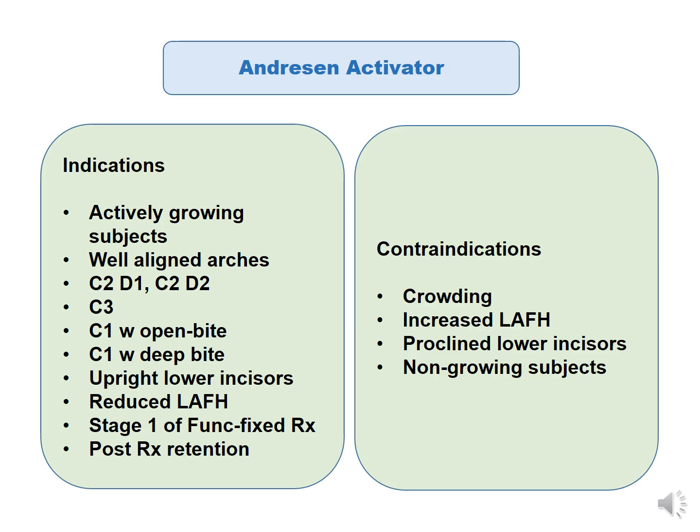The lower incisors should be upright. The lower anterior facial height should be reduced. It can be used as stage 1 of a fixed functional treatment therapy, and it can also be used as a post treatment retention.